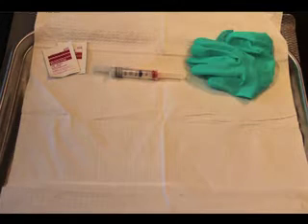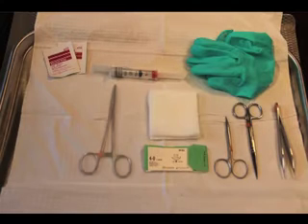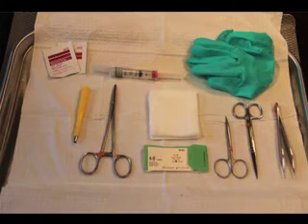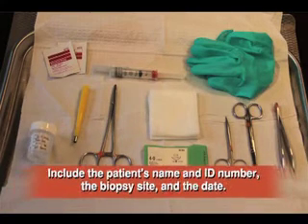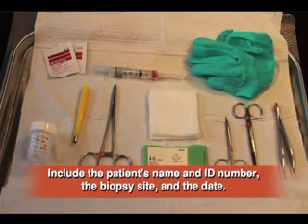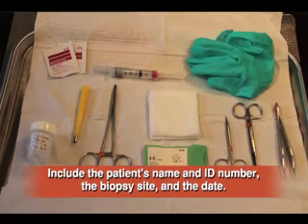Set up a standing tray with a clean disposable cover and place all necessary materials on the tray. While exercising clean technique is important, it is not necessary to maintain a sterile field. You will need alcohol pads, a local anesthetic, gloves, tooth forceps, scissors, suture material, gauze, a needle driver, the punch instrument itself, and a specimen bottle containing formalin. The specimen bottle label should include the patient's name, identification number, biopsy site, and the date.